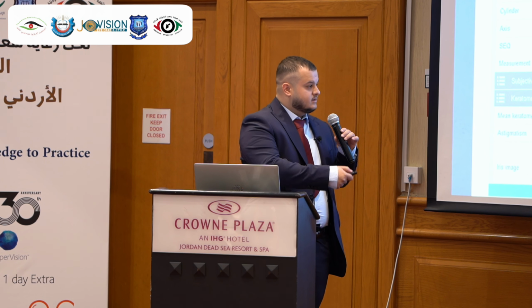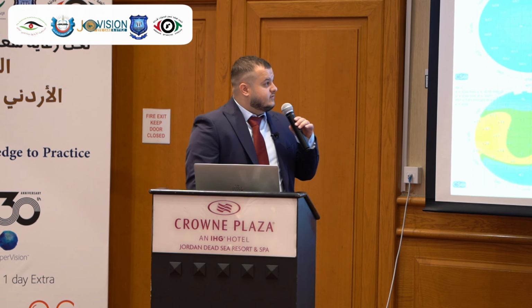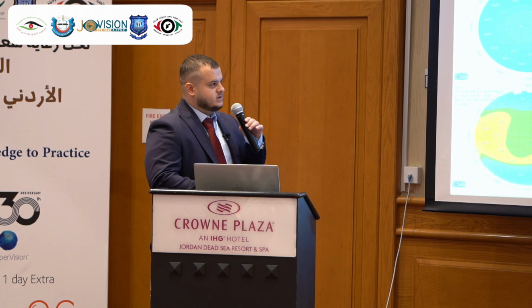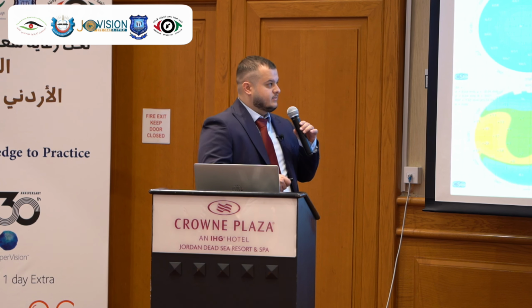The axial length changed by 0.08 in OD and 0.05 in OS. Also, the corneal curvature changed by 0.50 in OD and 0.62 in OS. This is the corneal topography for the patient, as we see here, corneal astigmatism with the rule. Before using orthokeratology, normal topography, and here is after 1 year of using Ortho-K, flat center and hyperopic edges.